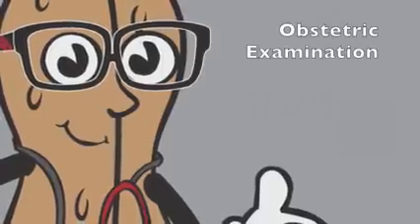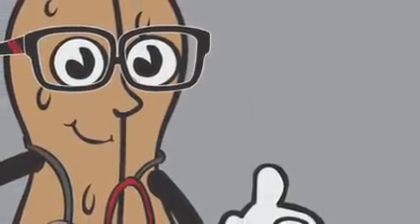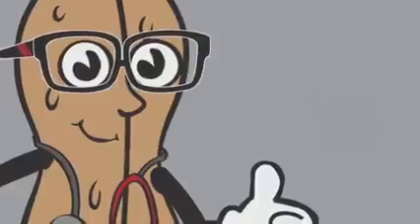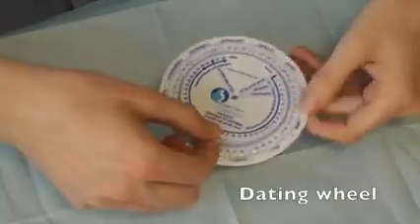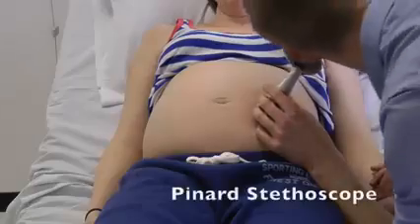Welcome to Medicine in a Nutshell's Guide to Conducting an Obstetric Examination. To successfully complete this examination, you will require a tape measure, a dating wheel, and a Pinard stethoscope.